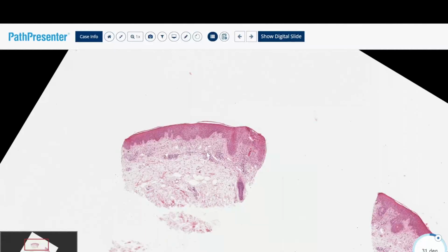Spongiotic dermatitis. So in low power, we can see some areas really had spongiotic changes, like this area kind of pale because there is more fluid between the keratinocytes. So we can see the cells have more space here. Other than this, in examination, it's really difficult to test you on spongiotic dermatitis because you will have tons of final diagnoses for this pattern. So everything from the dermatitis chapter is not specific. You have to have the clinical picture or maybe another scenario for you to make the diagnosis.